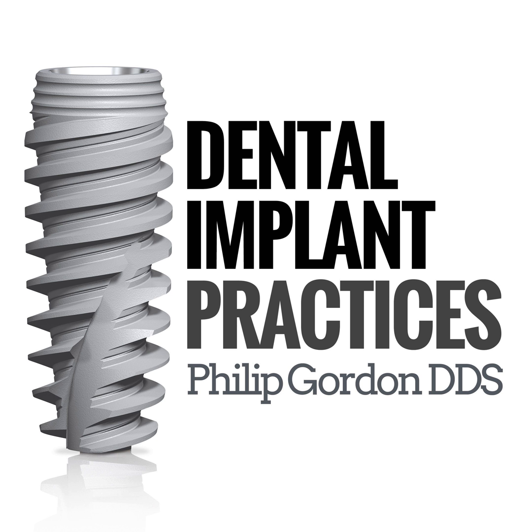Where would you like to see the field of implants moving forward in the future? Well, of course, everybody's into guided surgery. In fact, the Hahn kit, we simplified the guided kit. You don't have to use the spoons, which are cumbersome. So we simplified that on the drills, the hub of the drills serve as the spoons. And as they get more and more into the computer technology and guided surgery, I'm sure that there's going to be tons more things in the future.